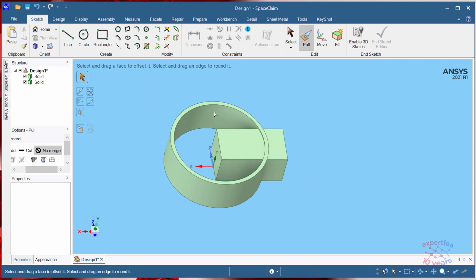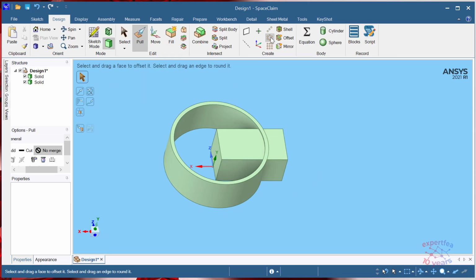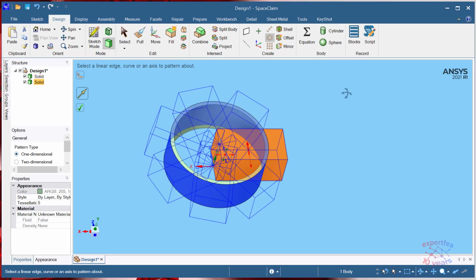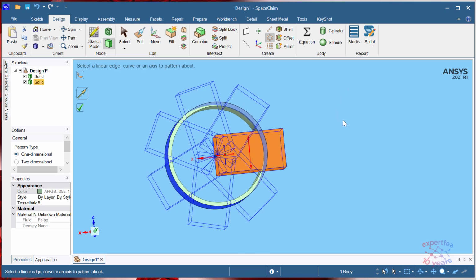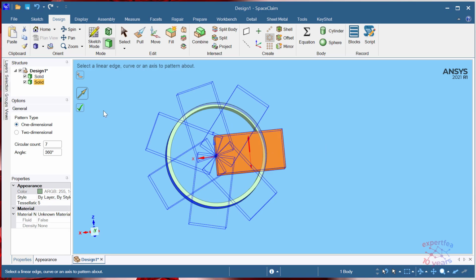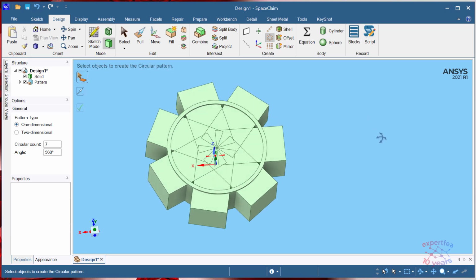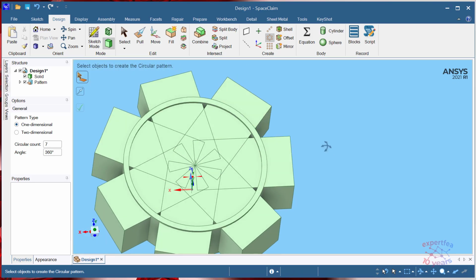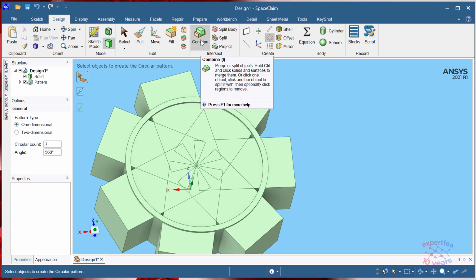Let's create a circular pattern here. It says select an object to create a pattern. I need this parallelepiped and also a linear edge as the axis. Let's select the outer face of the cylinder, and let's pull here, 7 bodies on the circle. Yeah, it says this. I'm curious about the remaining thickness that will be here. Let's check it. Let's do a Boolean operation.